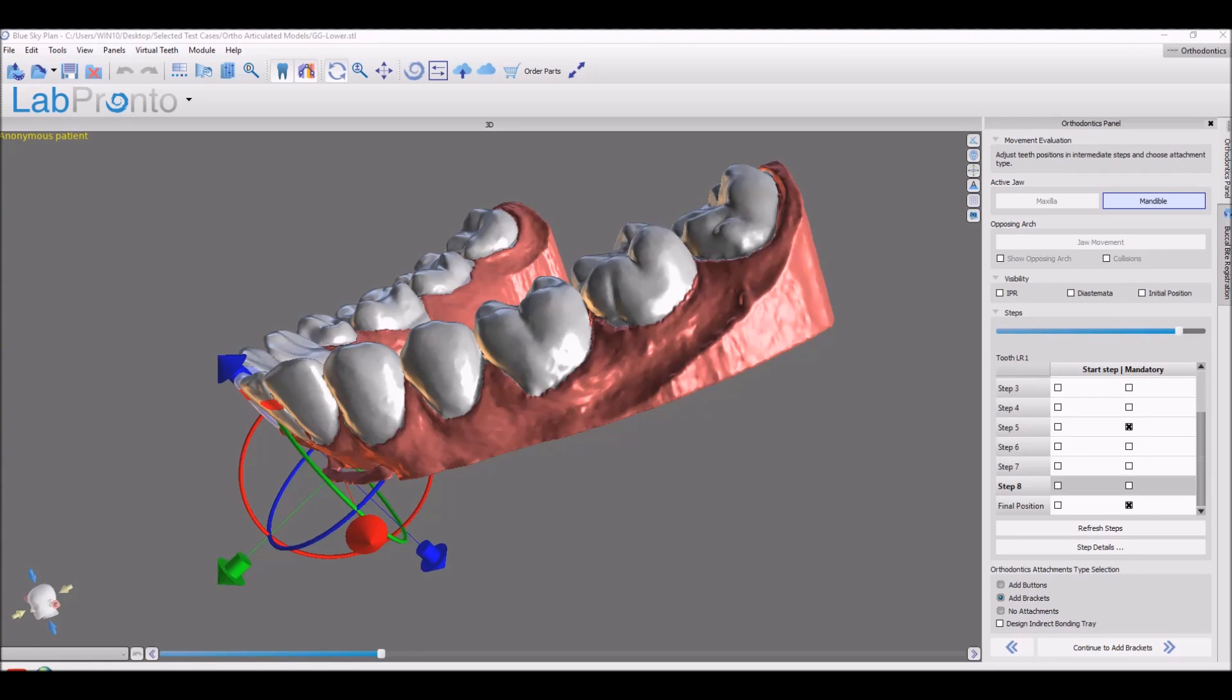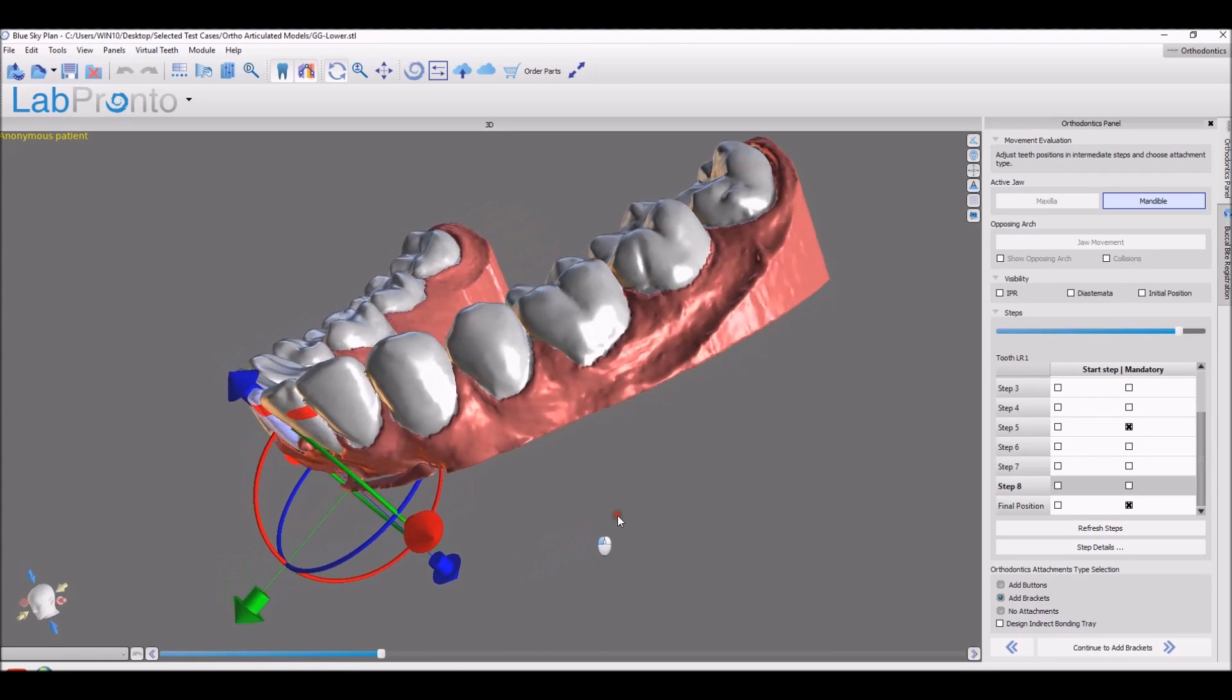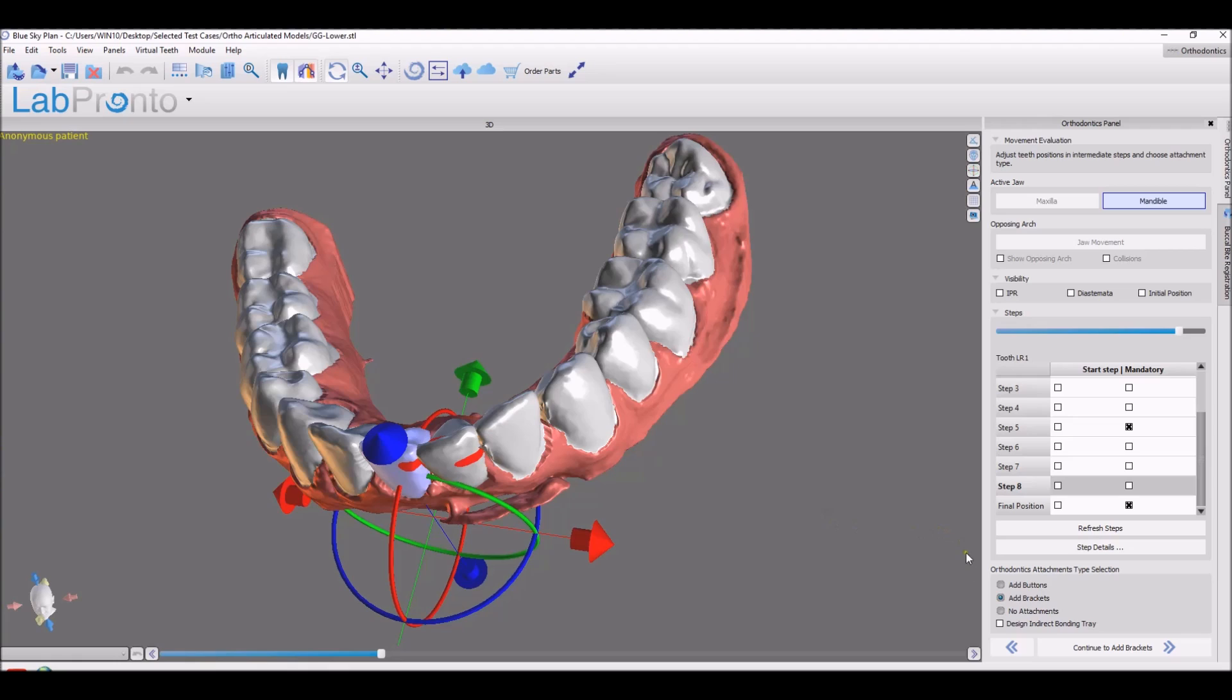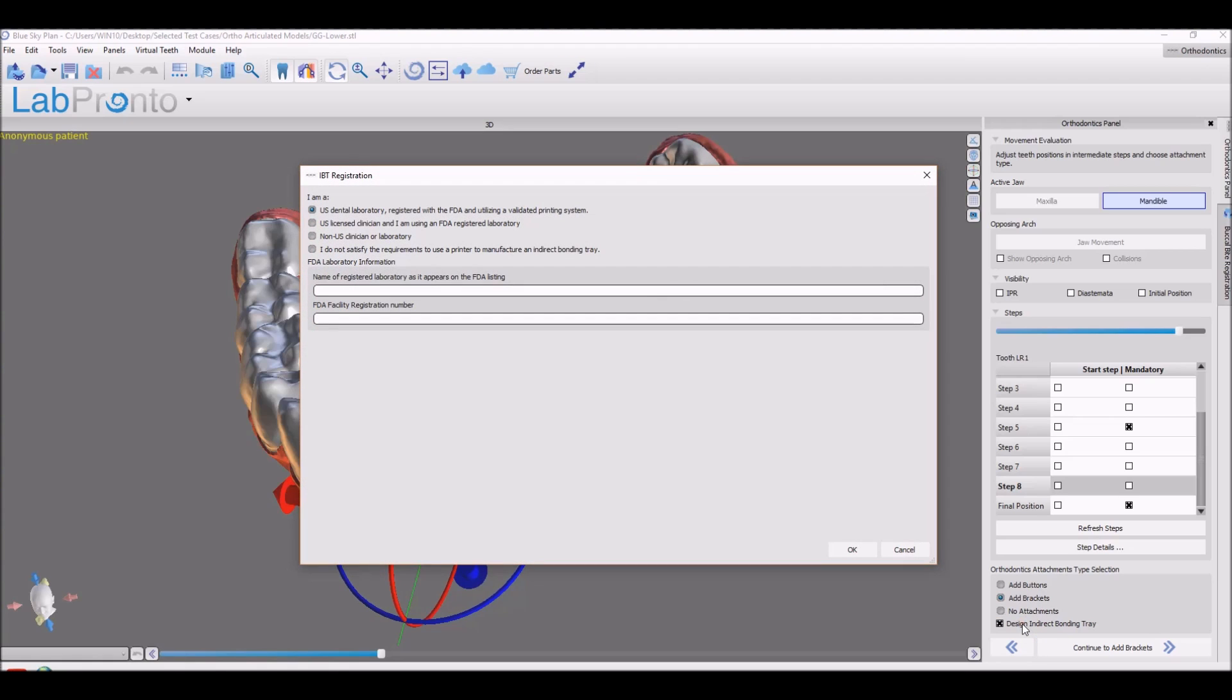Continuing our discussion in the ortho module, we've added the ability to design an indirect bonding tray. You can see on the bottom, you have the option to add brackets and choose the option to design an indirect bonding tray. The first time you use this functionality, you'll be prompted to complete a short form, which you can do the first time, and then you'll be done with that.